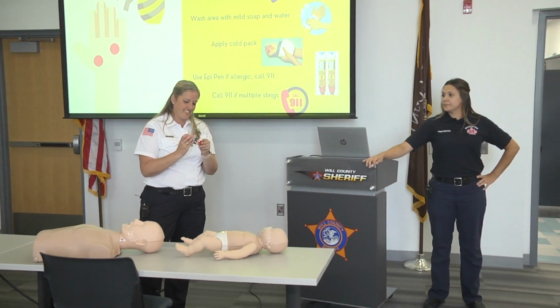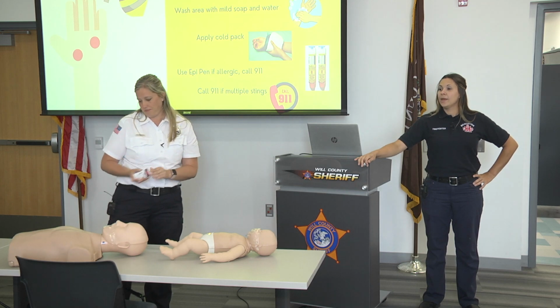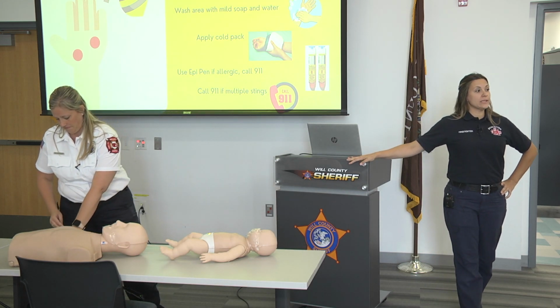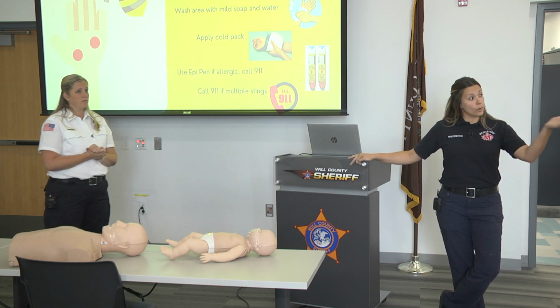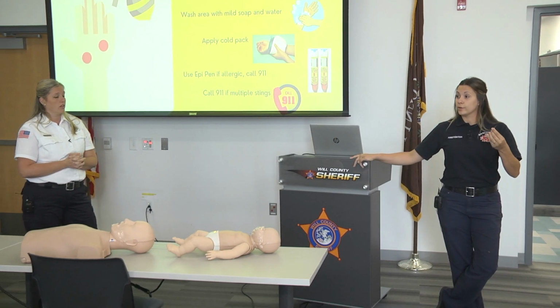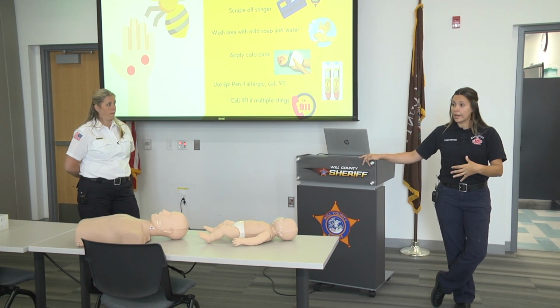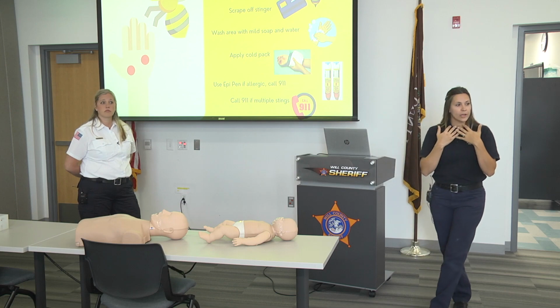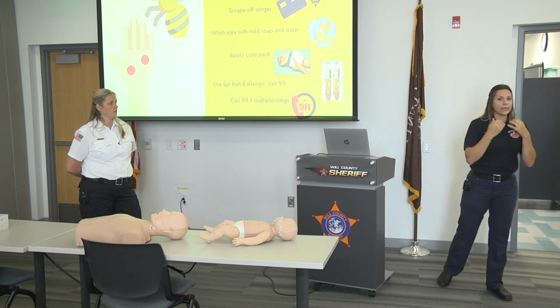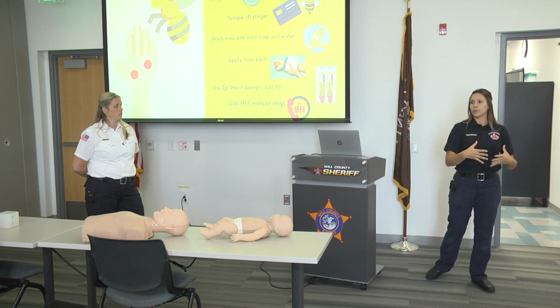So anyway, this is an Auvi-Q, is what this one is. And identifying when someone needs an EpiPen is really important as well. We want to make sure that we know, okay, now is the time we use this. There could be swelling in the lips. They could have a hard time breathing, break out in hives. Children will sometimes say, when they're having an allergic reaction, I feel like there's fuzzies in my mouth, there's a frog in my throat, I can't breathe. You'll be able to notice, especially if there's a lot of swelling and hives.